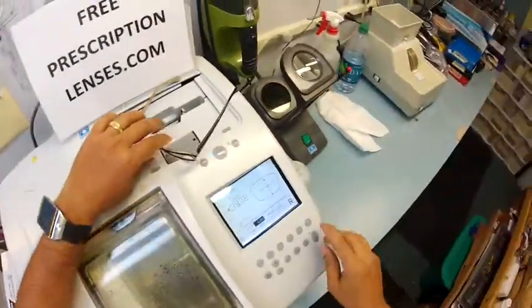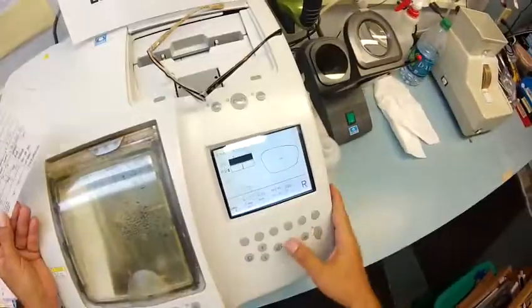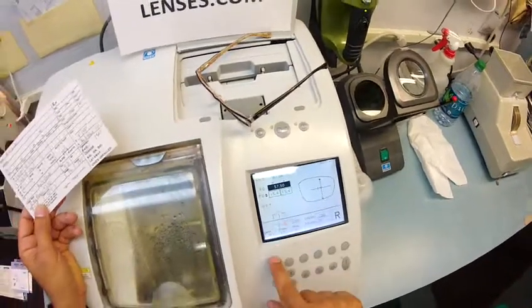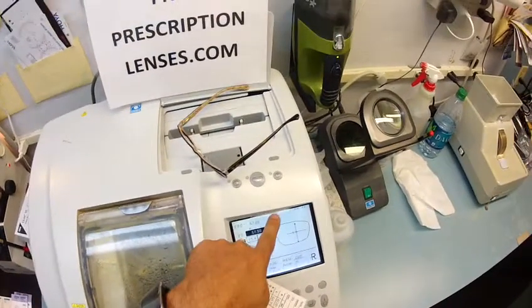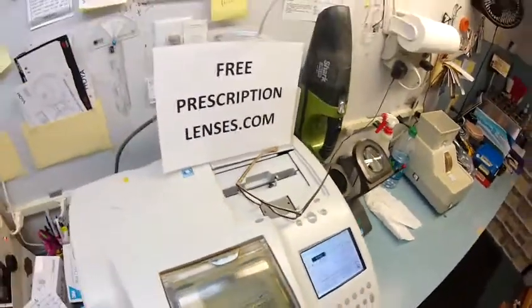So that is done. I'm going to pull your shape up on the computer. I'm going to type in your pupillary distance of 57.5. And got it. These are polycarbonate lenses. I'm going to cut them on soft because of the anti-glare coating. And this is being cut for a plastic frame.